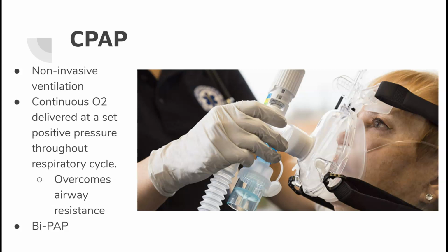Basically what happens is you put this mask on the patient and it just blows oxygen into the lungs, and it keeps everything open regardless of what stage of the respiratory cycle you're in. This CPAP in particular also has an inline nebulizer. You do need a secondary oxygen source in order to aerosolize whatever you are nebulizing into the CPAP. You can also see here they have her on the side stream.